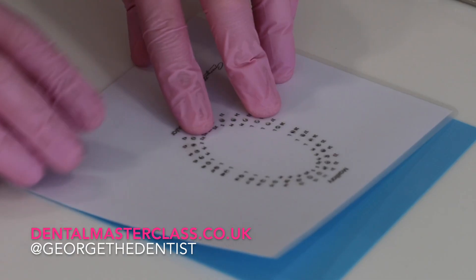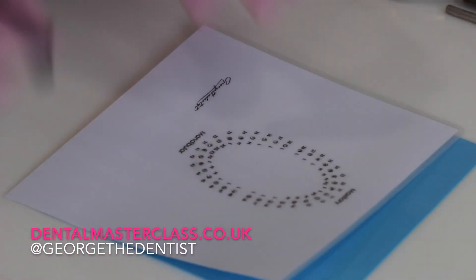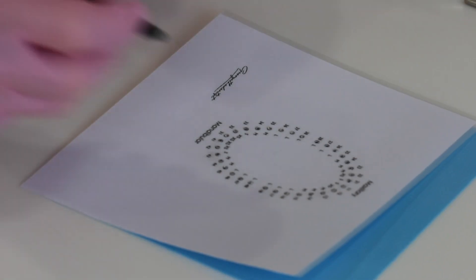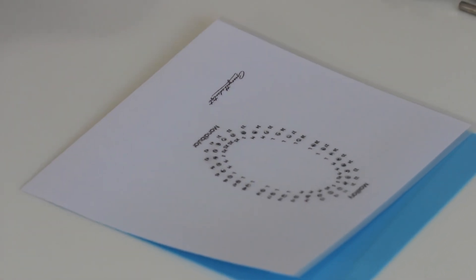Because I'm going to be working on a lower six here, usually what I'll do is just isolate the whole quadrant. If you just isolate that single tooth and you're doing an occlusal filling and it turns into a DO or an MO, then you're going to have to take the whole rubber dam off and isolate again. So it just makes it simple to do the whole quadrant in one go.